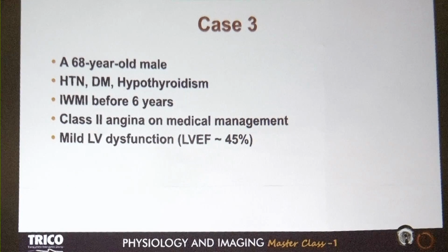See, after seeing this, and when I was evaluating both the images, I searched through the literature, and in one place in Gary Mintz's article, I found this thing: dense fibrosis at times mimics heavy calcium.